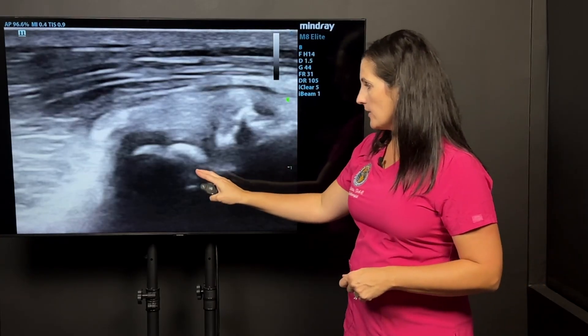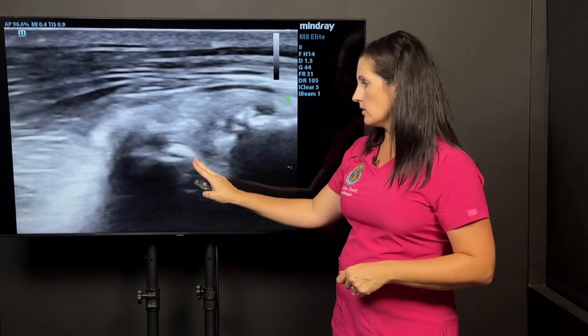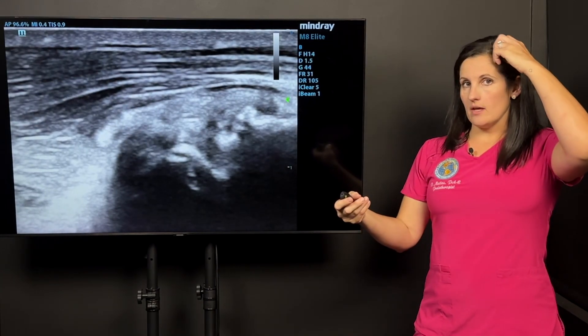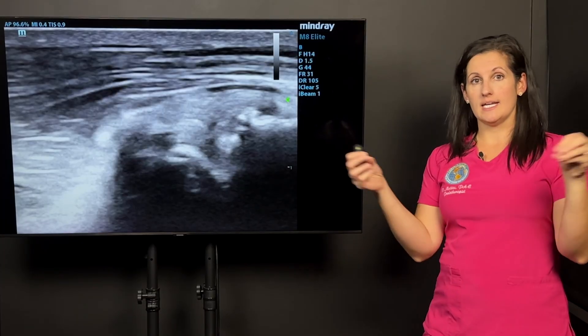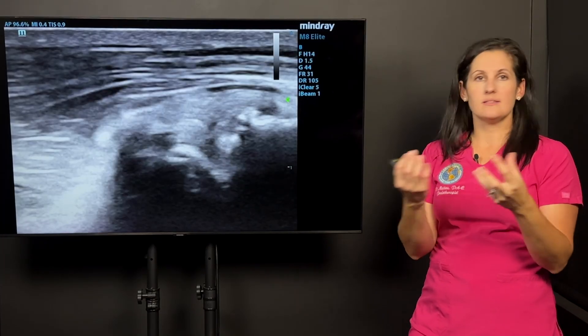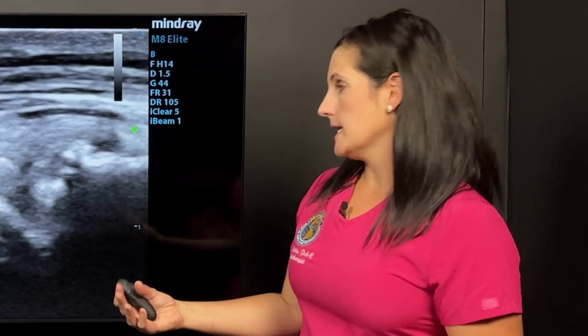I just kind of tug on the joint and you can see how it opens and closes. That's another way we can determine if a joint is unstable. I'll often do the ultrasound and the x-ray together to put all the pieces of the puzzle together — to determine if this patient is a good candidate for prolotherapy or PRP, what that treatment plan looks like, whether we need to incorporate bracing with exercises or certain therapy and rehab. What all goes into getting this patient better?